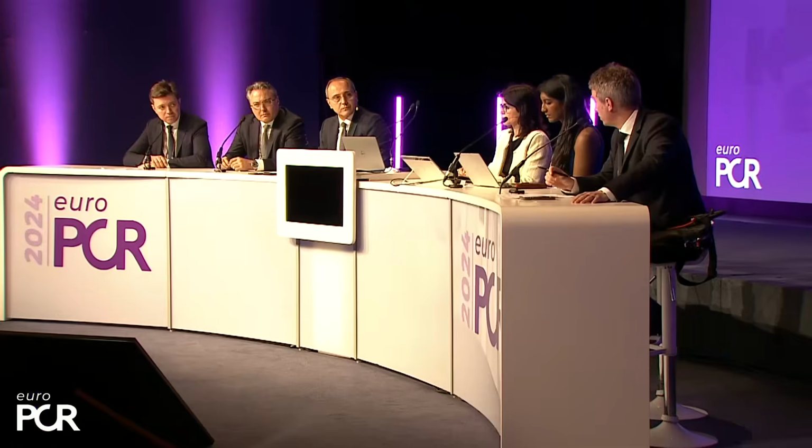Next question here I have is, how do we estimate the burr size? You might have your own protocol. We didn't manage to do IVUS here. IVUS could have helped to select burr size. What is your recipe? Perhaps Robert, what is the burr size to start with in this case? I think we tend to size with a burr to vessel ratio of 0.5 to 0.6. I mean, I know it varies depending on which guidance you look at, but these are the ballparks that we use, and we should apply to this case as well.